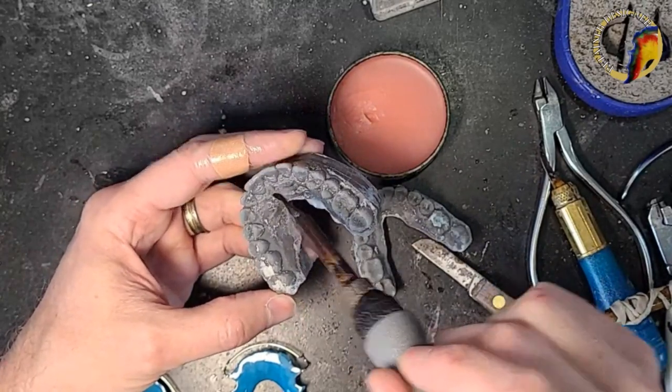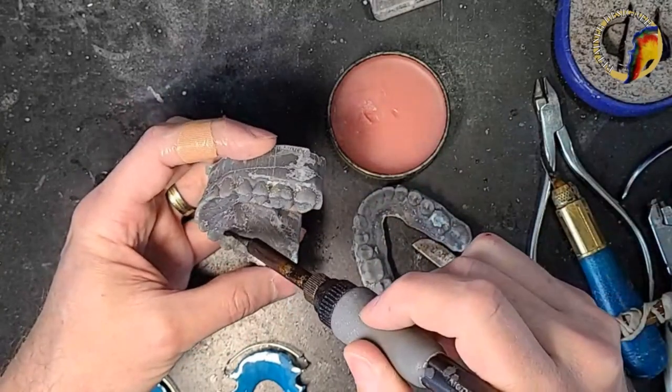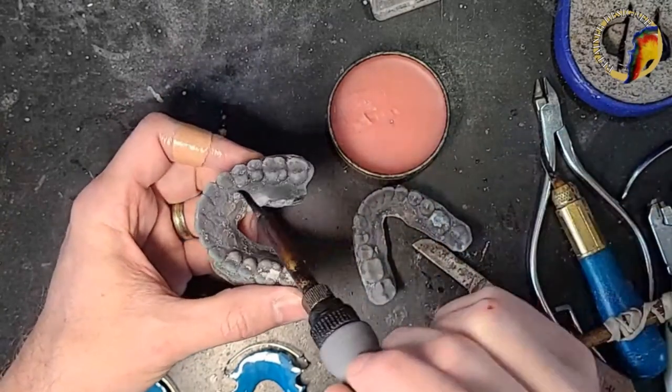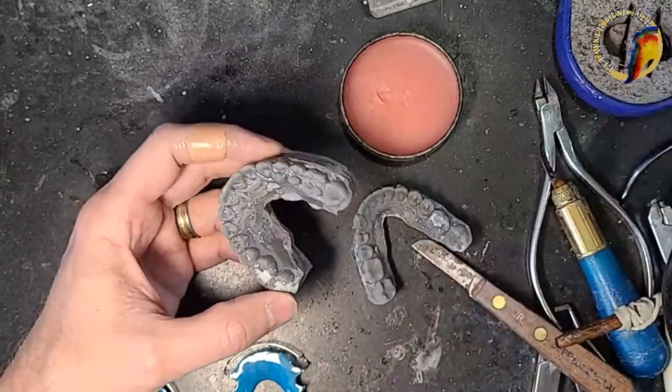I'm blocking any undercuts — anywhere I think it needs it. There's a little undercut right here I'm going to block. Any undercuts in 3D printed models I've preached on for many weeks through these live streams — I need to block them out because 3D printed models are not forgiving.